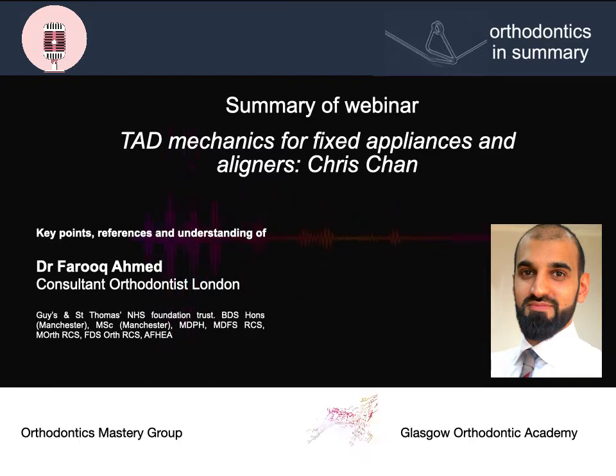Chris spoke about how he uses TADs as part of his aligner therapy. He spoke about, for his distalization cases, he will initially distalize the molars. Subsequent to that, he places TADs and therefore retracts the canine directly to the TAD.